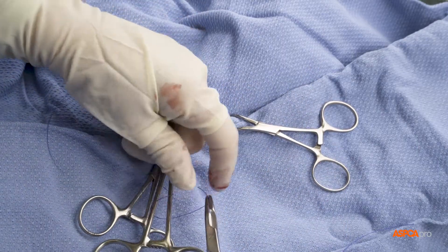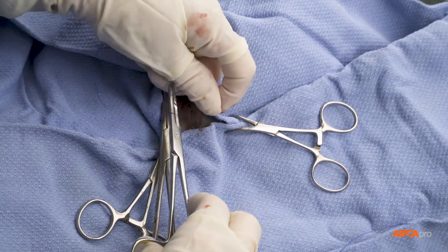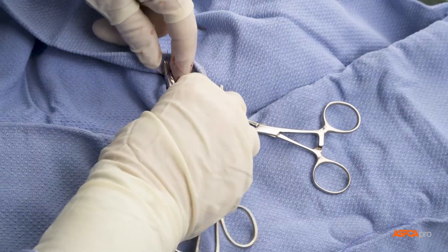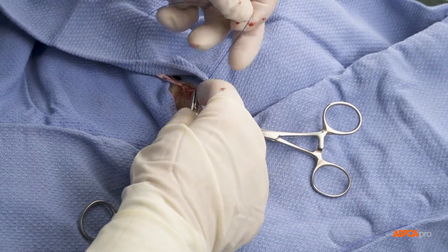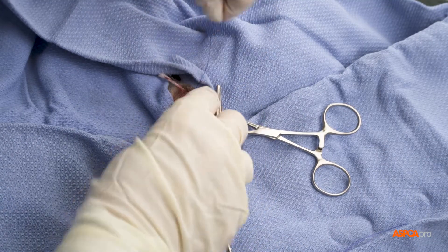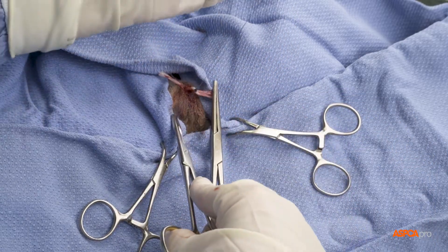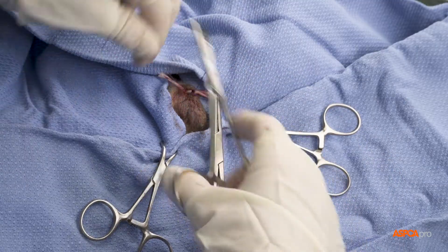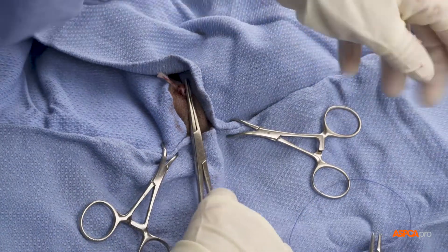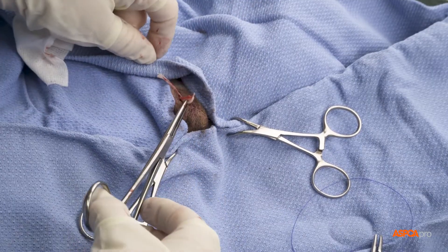A strangle knot is set up around the clamp, then placed on the cord and tightened. Additional throws are used to secure the knot, and the knot is inspected before returning it into the scrotum.